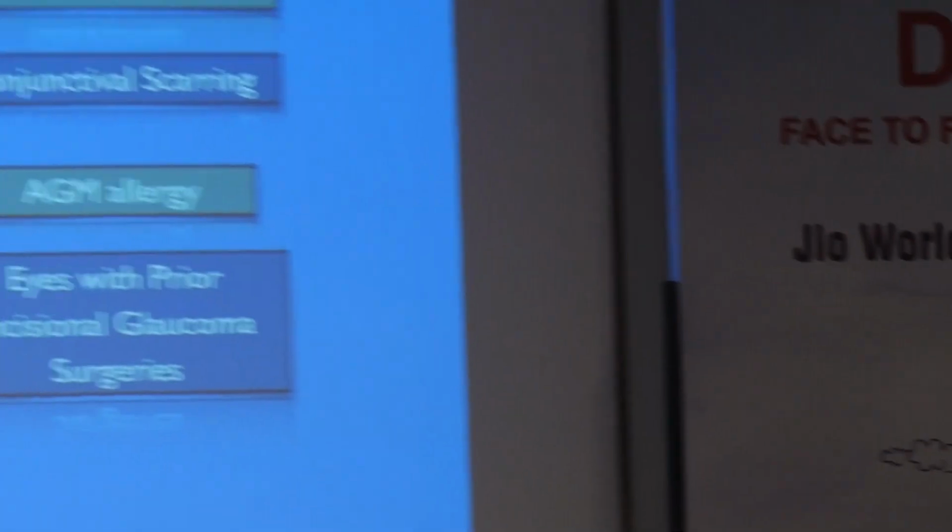The indications are the same as any of the MIGS procedures that we do, mostly to start with POAG patients or JOAG and other forms of secondary open angle glaucoma, and we can even do it in congenital glaucoma.